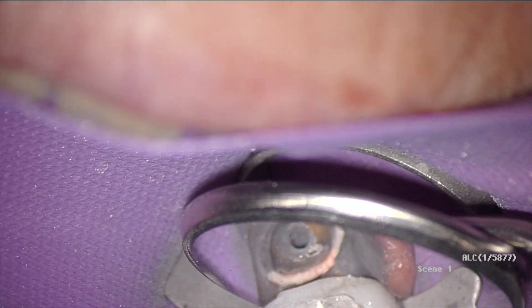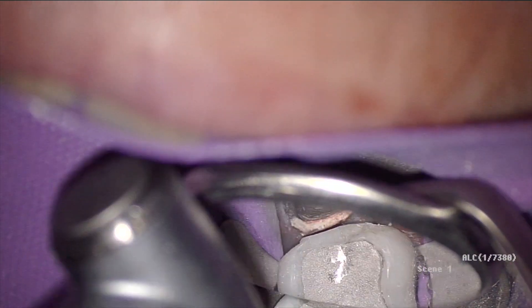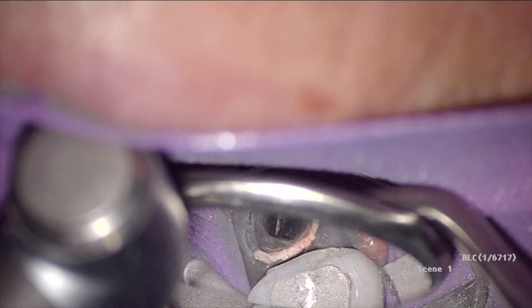We're slowly going to make our way straight down the tooth removing — I'm just removing some of the core material on the occlusal part and slowly going down. It's pretty straightforward. It's easy to perf because these teeth are really small, but you've got to remember that I have more room typically buccal-lingually. Practice on some extracted teeth if you're doing post removal. This is his preference so I'm just doing what he wanted — remove that post to place his cast post and core. I'm zooming in to see, waiting to see that beautiful pink and not red bleeding red. That's the difficult thing — that's why I'm looking forward to using the iPhone all the time, because I can see if my image is centered right next to my face. Right now it's right behind me — you can see it's at the bottom of the screen, which is actually quite frustrating.